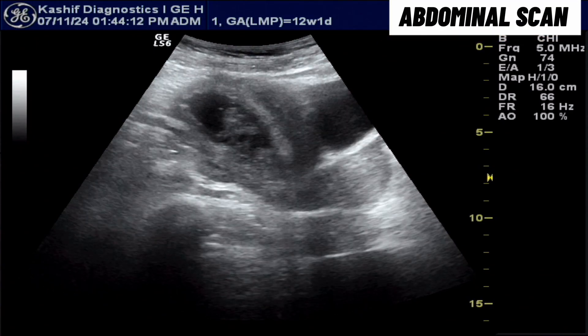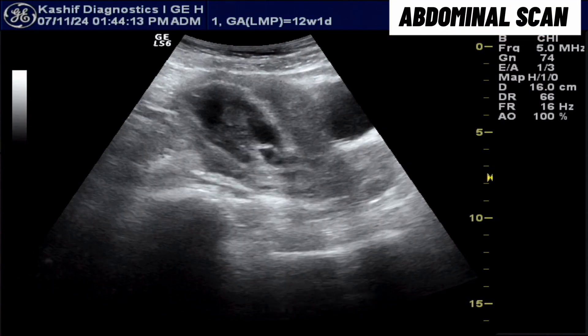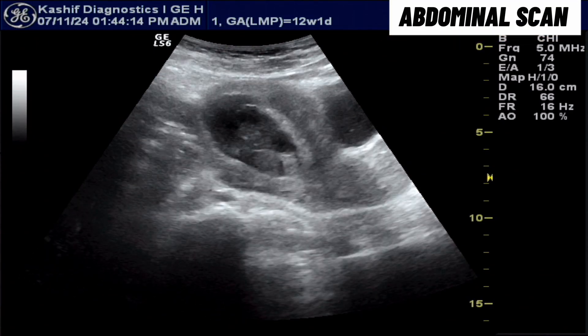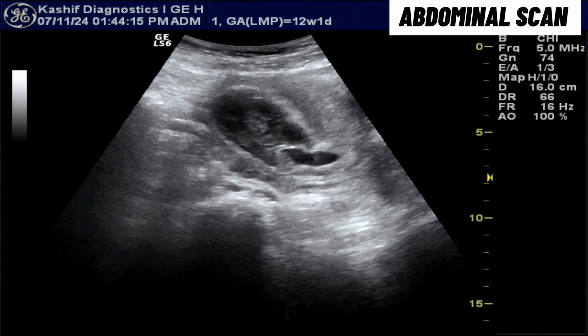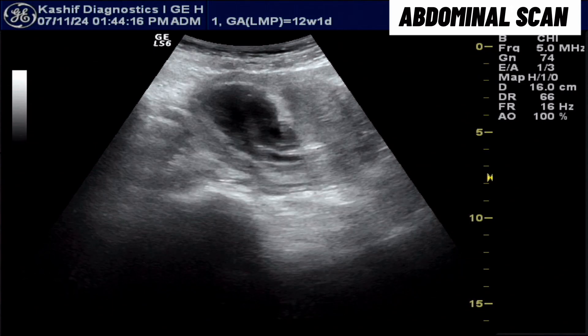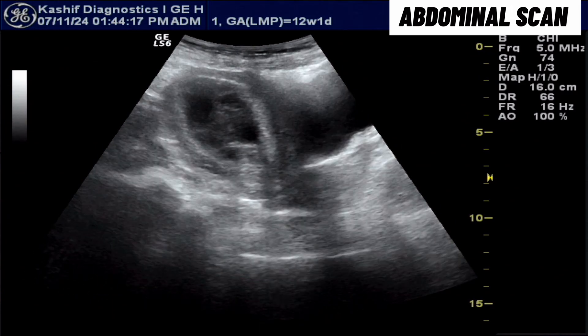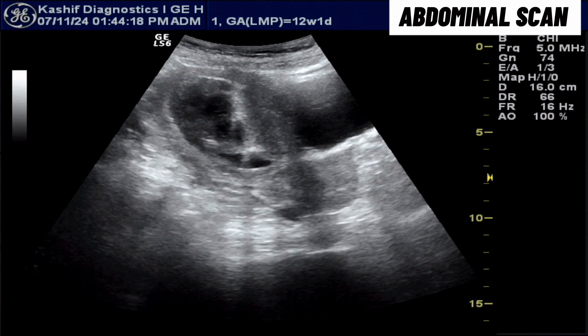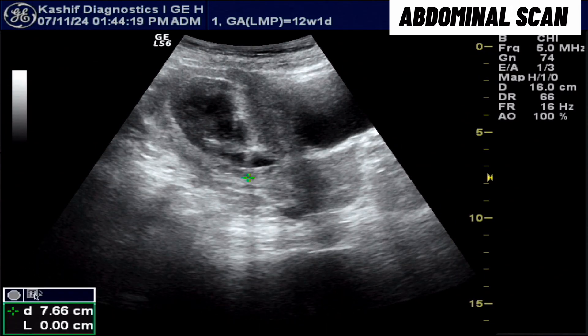This female patient with pregnancy of about 12 weeks presents with a history of vaginal bleeding and pain from the past day.